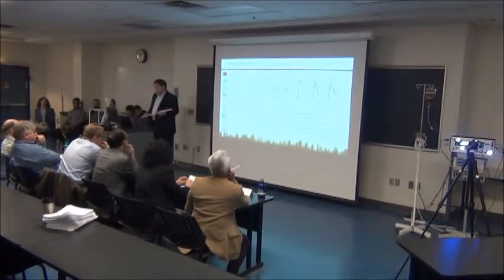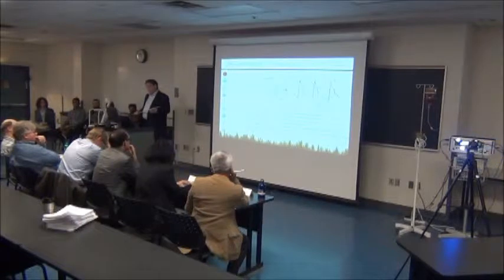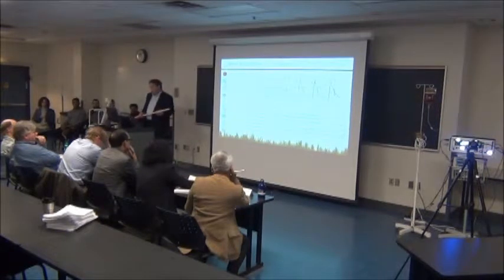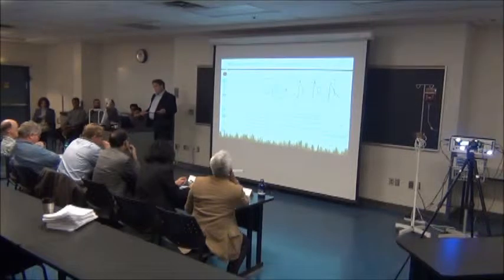What does the transducer give us? The transducer puts out a signal in the millivolt range. For example, 80 millimeters of mercury of applied pressure could give 8 millivolts. We have to amplify this small voltage to produce a strong noise-free signal for display. For example, we could amplify this 8 millivolts by 100 to give 800 millivolts.